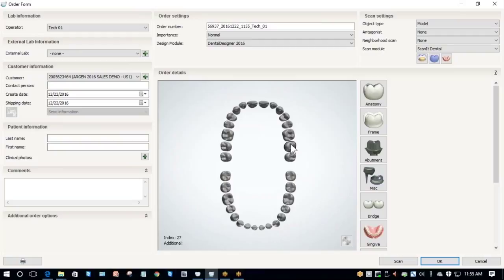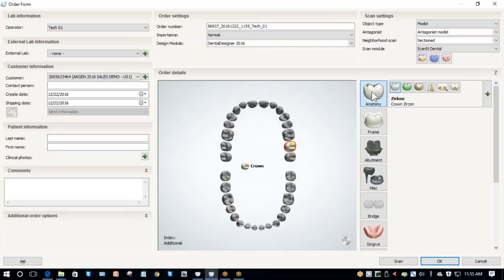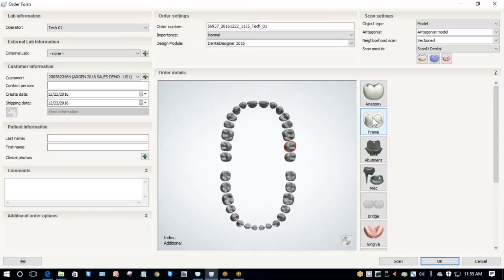From here I need to first select my tooth number. For this case it's tooth number 15, and then I need to select my indication. For this case I'm working on a crown. When I select anatomy, that tells the system I'm working on a crown.